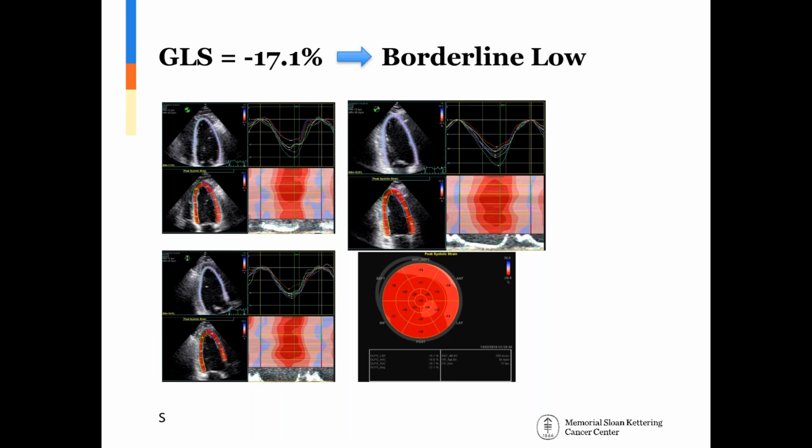Right. So I absolutely agree with everything that's being said, but to specifically address the dropout, generally if there are two or more segments that cannot be measured, we will not report out GLS. And I just want to second Jeannie's comment that, just like any new technique, there has to be education, there has to be awareness, there has to be knowledge on how to interpret it.